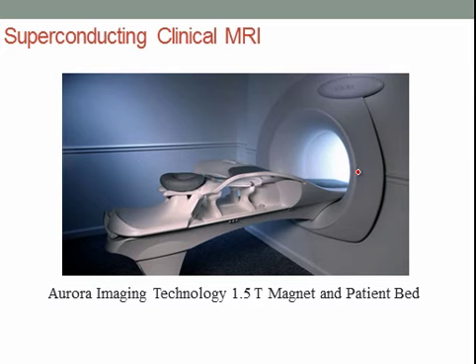Now one of the advantages to this setup, by the way, this is Aurora Imaging Technology. I used to work there a couple years ago, and they're right in North Andover. One of the advantages is the woman's head is outside of the bore. So if people are claustrophobic, this can reduce that feeling of anxiety of being inside a closed space, because your head is mostly out of the bore. The woman's head will end up right on the threshold of the entrance of the bore.